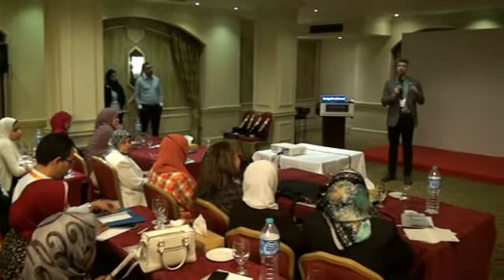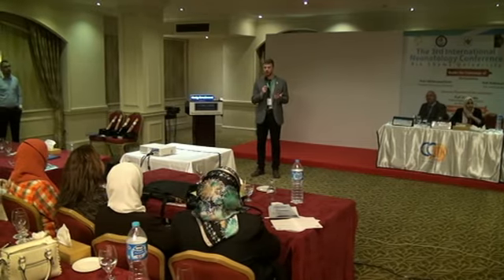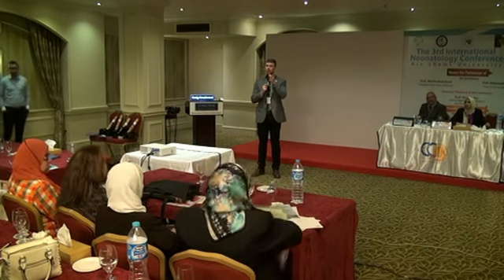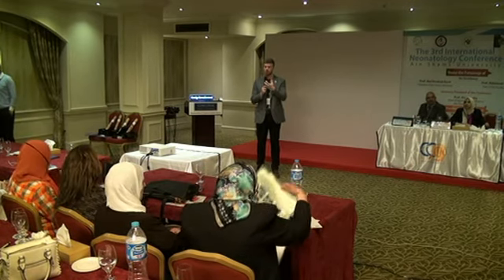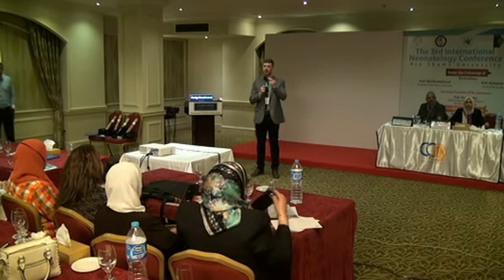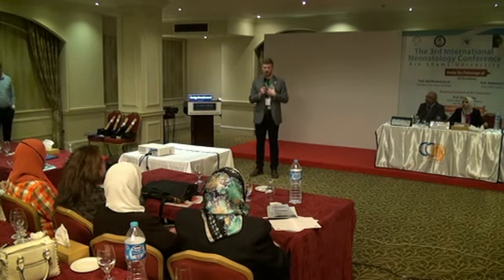So, correct me if I'm wrong, but I heard it basically. I talked about rebreathing, and that's generally bad. It's generally a function of too much dead space that we've put on them, whether it be an adapter or circuit components, an Omniflex, if you know what that is. If there is CO2 in that and the patient breathes it in, the best solution would be to reduce that volume of dead space. Our practice is always to reduce the amount of dead space so much as we don't have rebreathing. That's basically all you need to do.